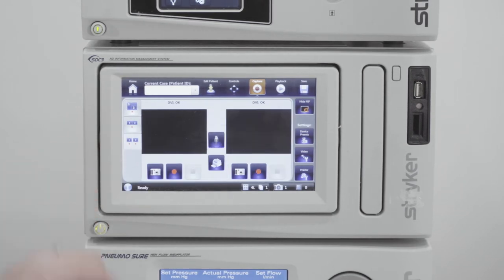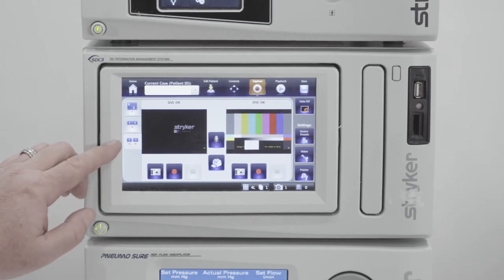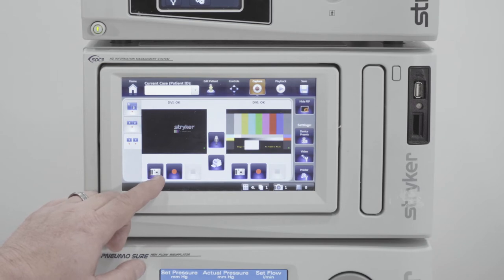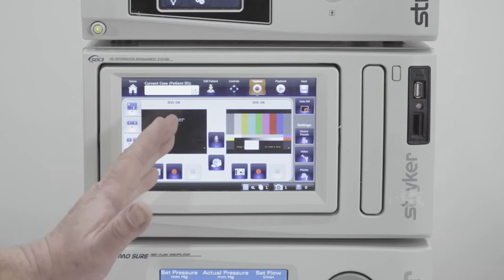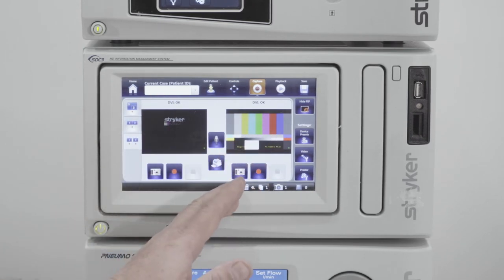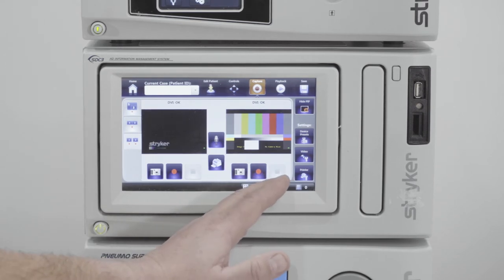To independently take a picture and independently take a video on each channel, you need the third option. This shows you: camera button for a picture, video button to record, and stop to end the video — for channel one. Channel two has the same controls: camera for picture, record for video, and stop the video.